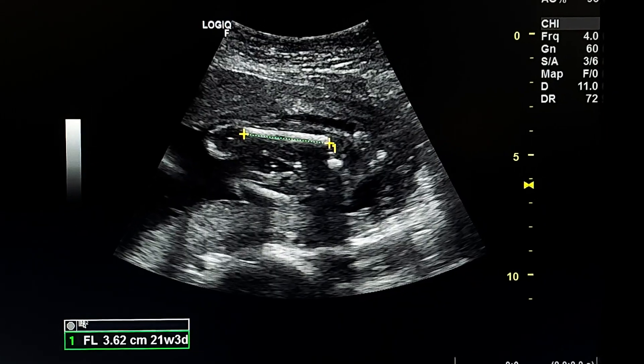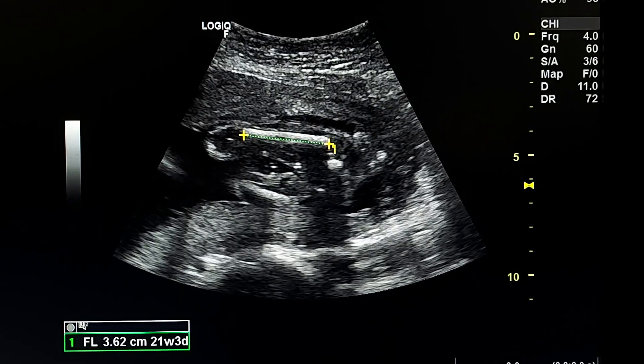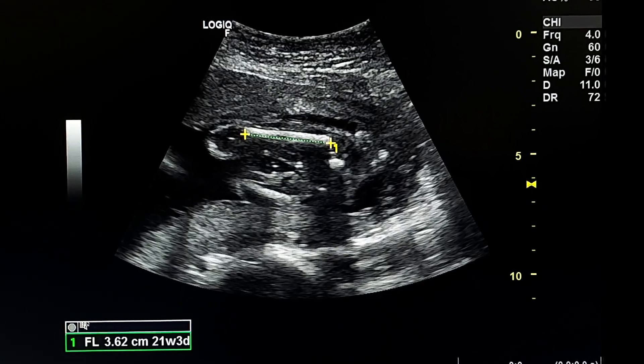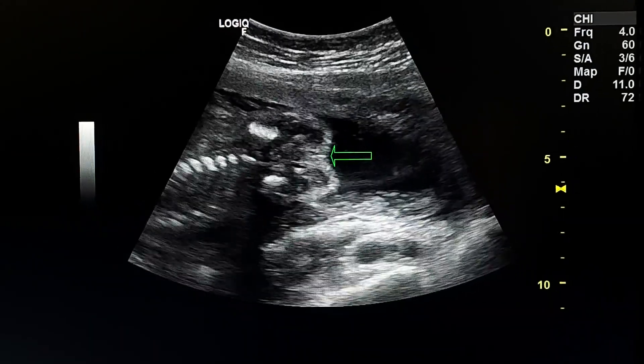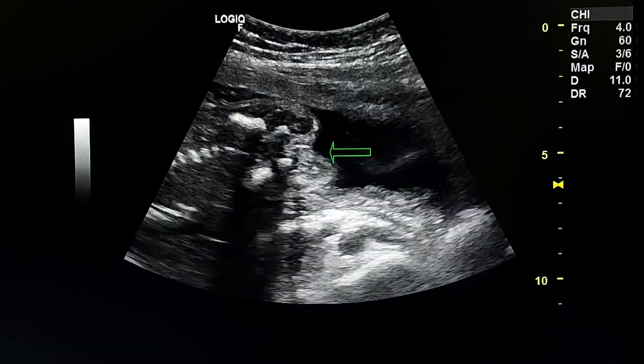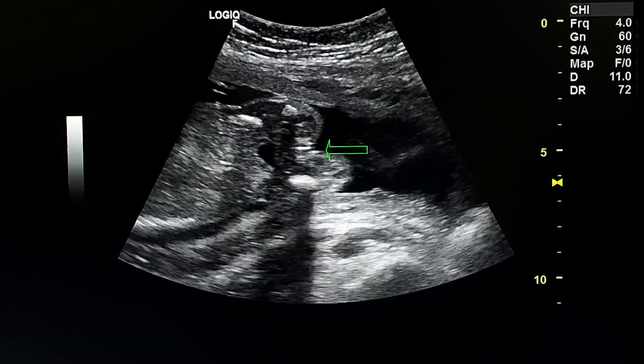Femoral length measures 21 weeks and 3 days. Here we see that the gender is female.